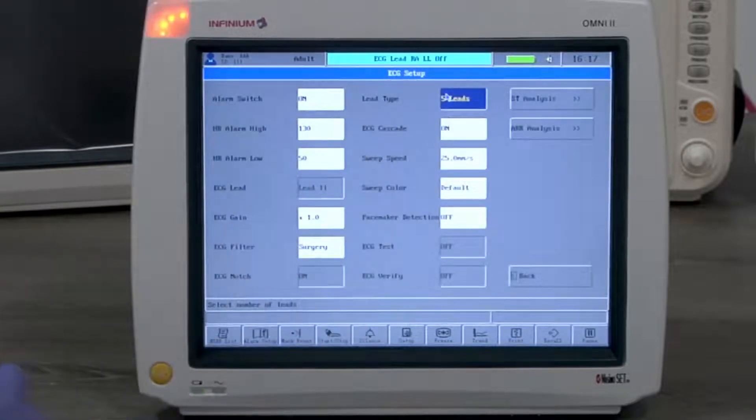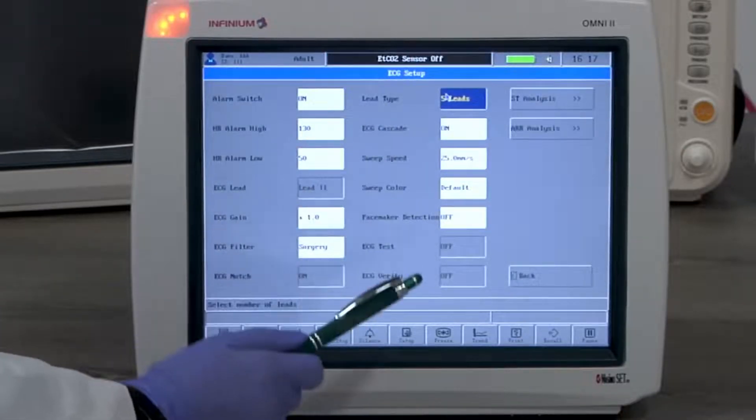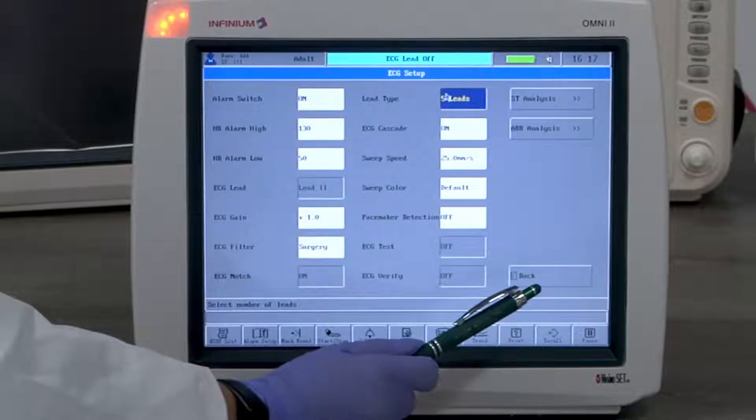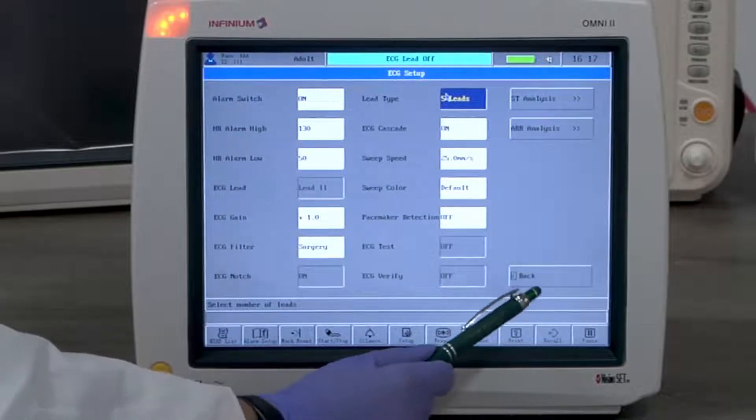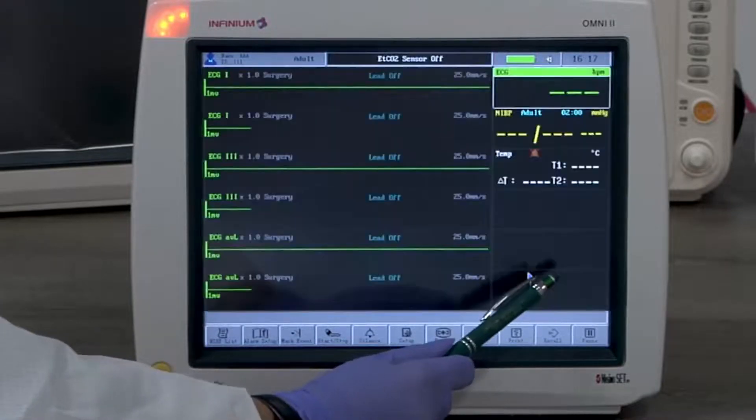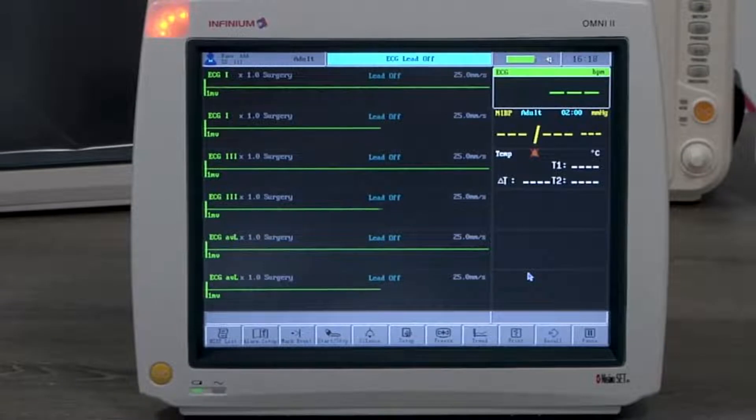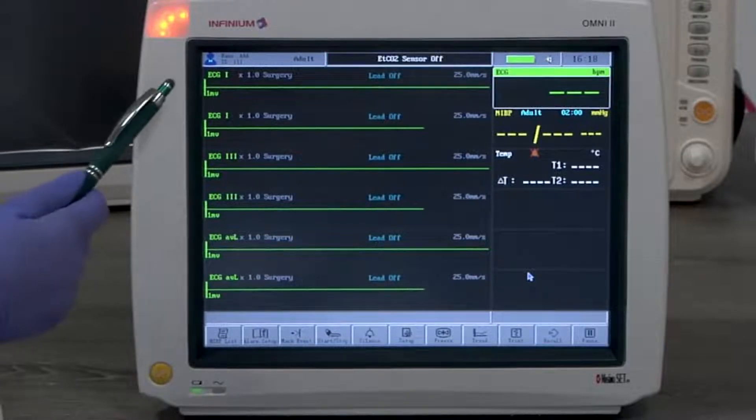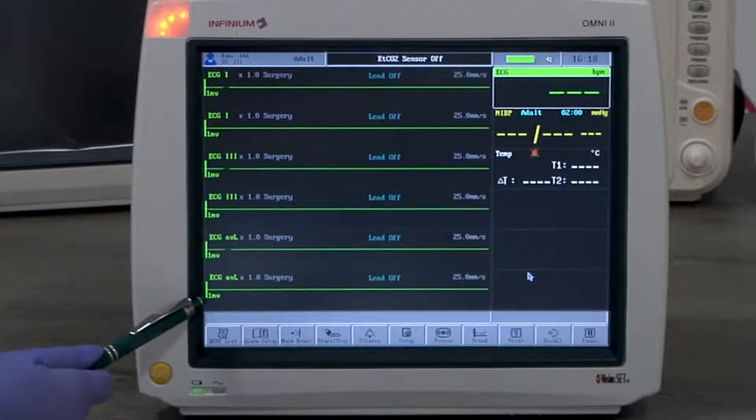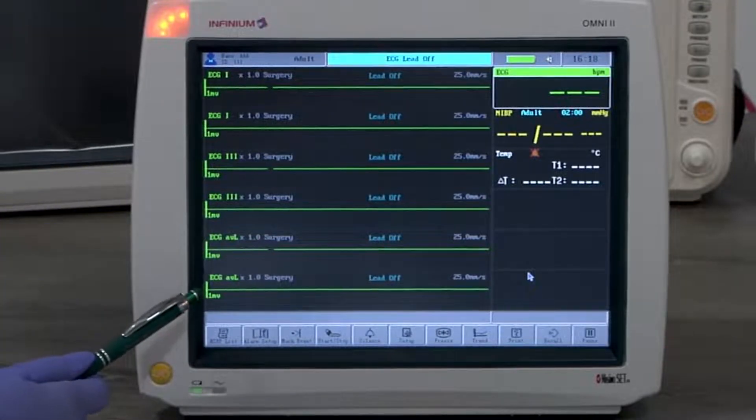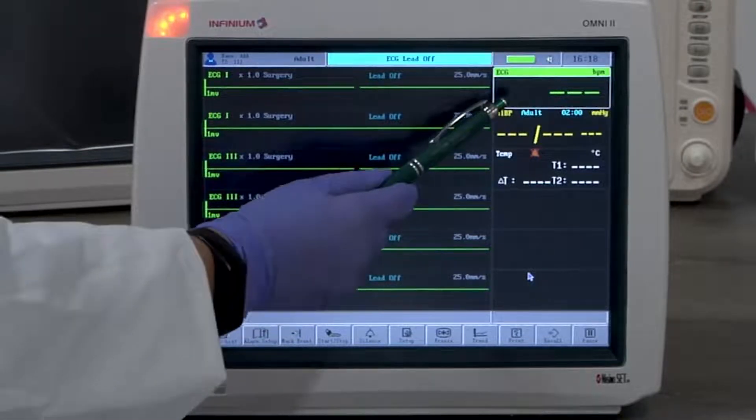The default display setting for Omni 2 is 6 channel display with 6 ECG waveform windows on the left. One ECG reading window, one NIBP reading window, and one temperature reading window are on the right.